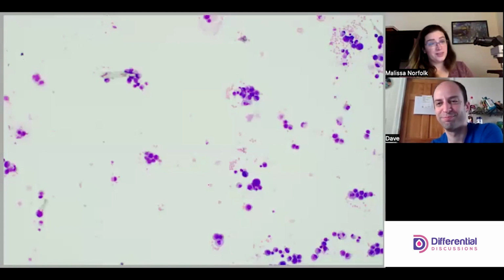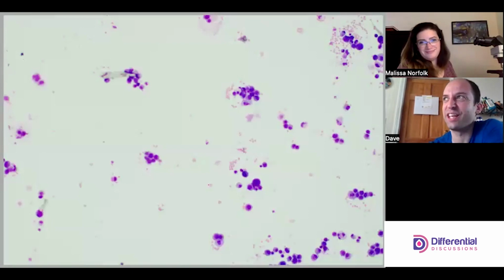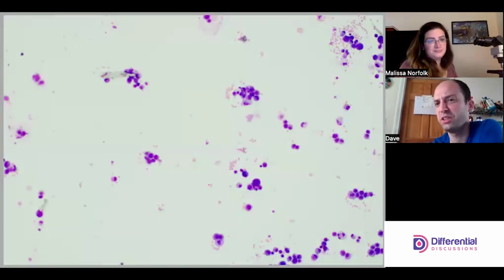And we're back with another CSF. Quite a colorful CSF so far. Yeah, quite an ugly dark CSF. So instantly when I'm like, oh, it's time to look at a CSF, I expect to see lighter coloration, right? This is punch-me-in-the-face kind of dark colors.